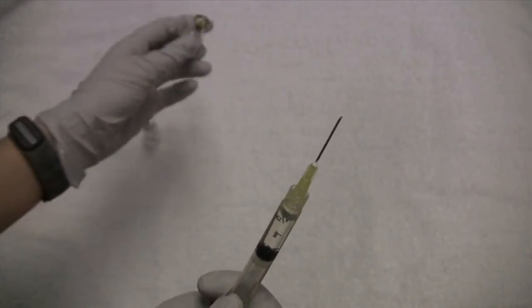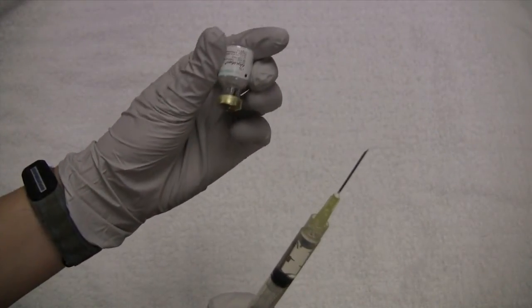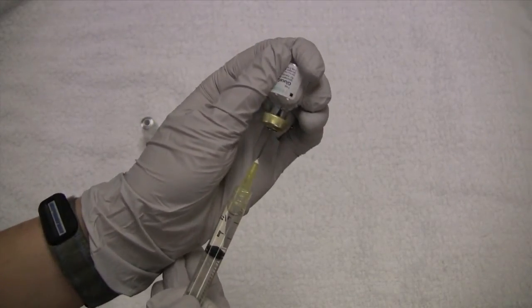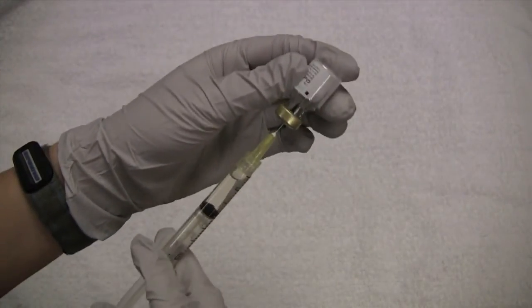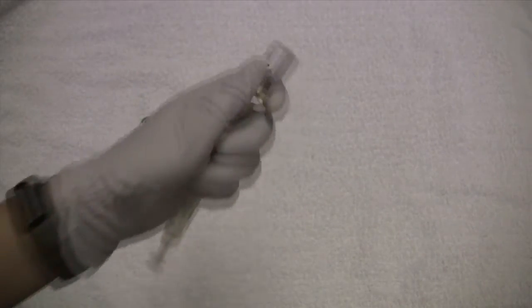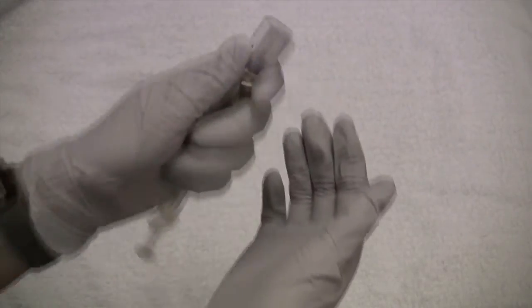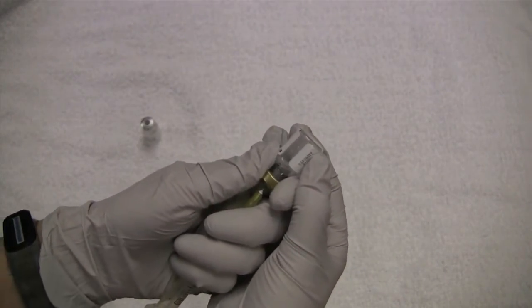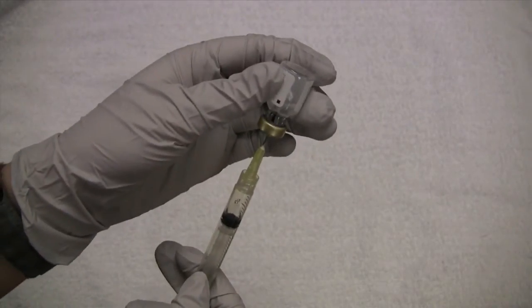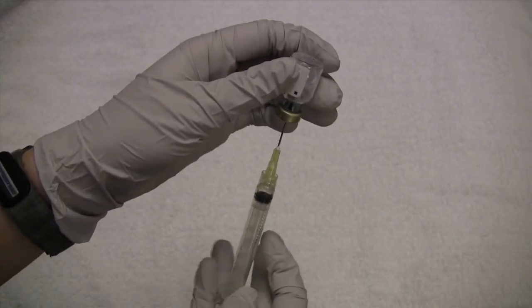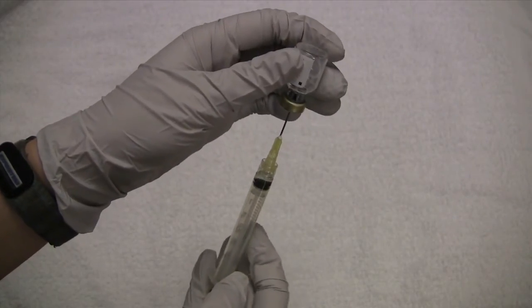Now I'm going to grab my glucagon and put the sterile water in the vial. Next we shake it up and it's pretty good at diluting pretty quickly. You can double check, make sure you don't see any powdered marks, and then draw up the medication.